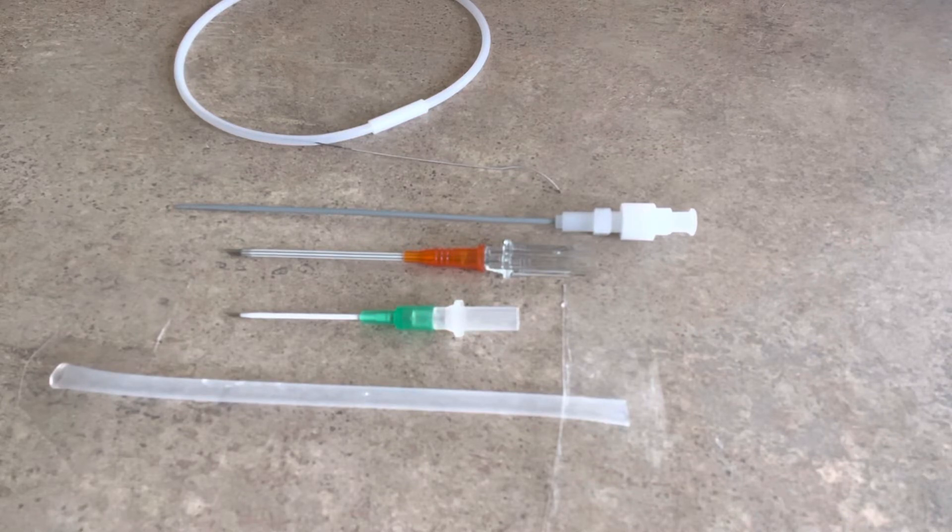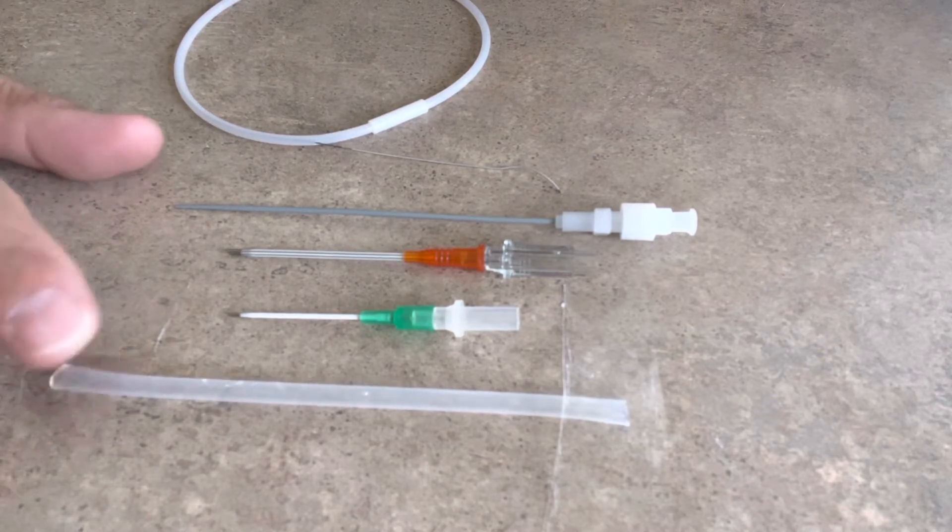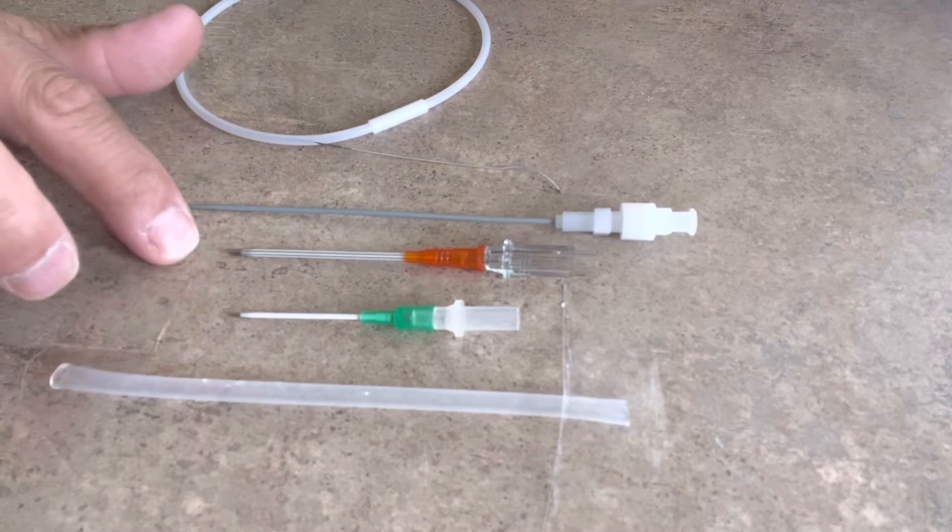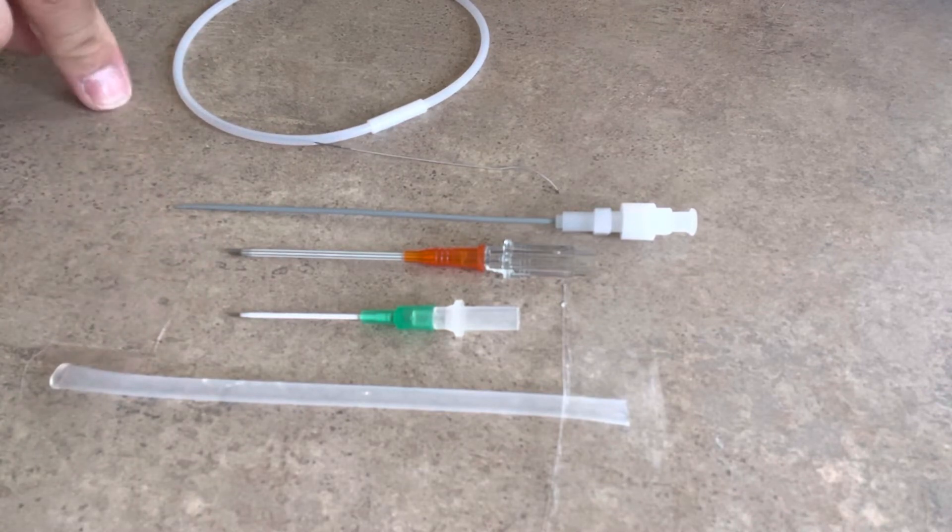And so these are the components that we're going to work with. We have a simulated blood vessel, 18 gauge angiocatheter, 14 gauge angiocatheter, a micropuncture dilator, and a micropuncture wire.